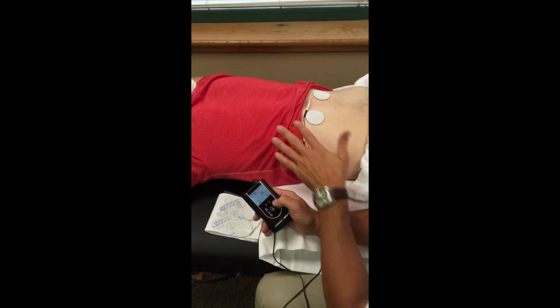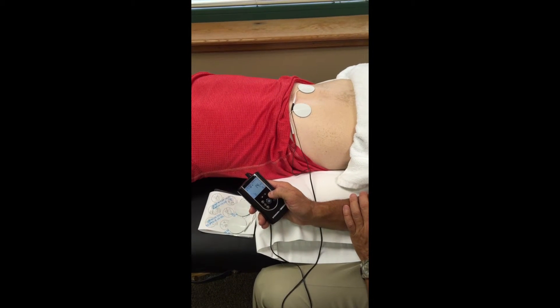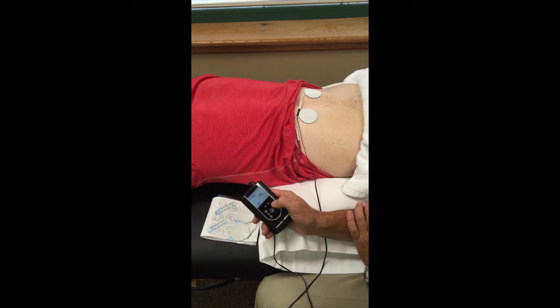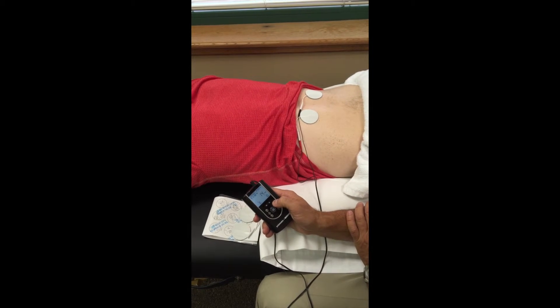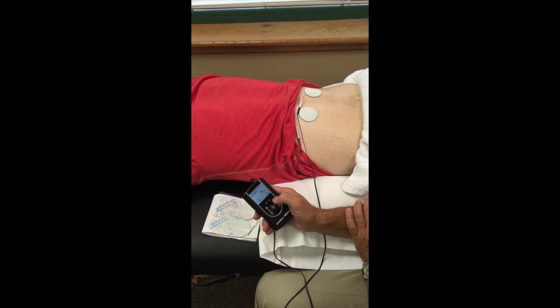Tell me when you first feel a little bit of a tingle. You start to feel the tingle, and then I want it to be fairly strong but comfortable to you. So you tell me when. — Right now.